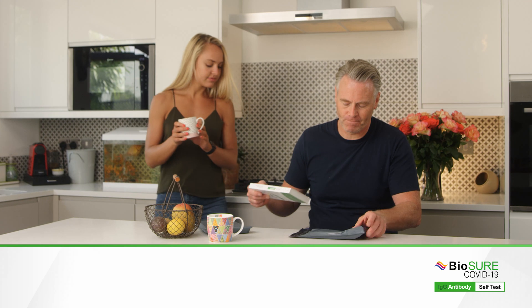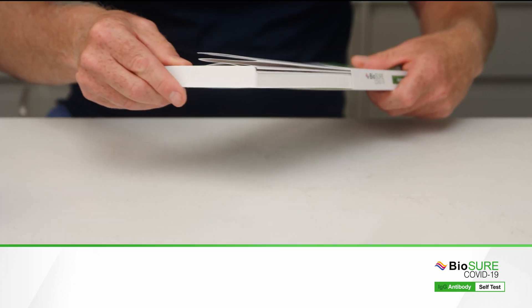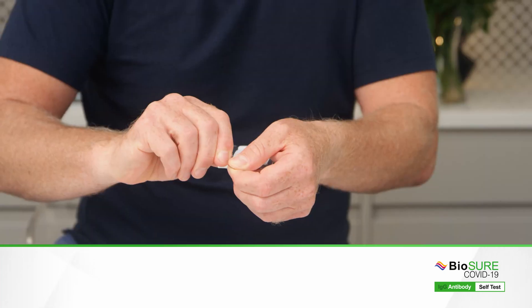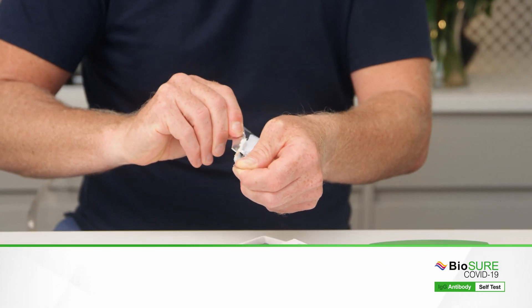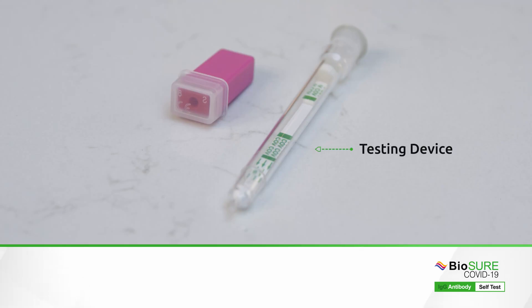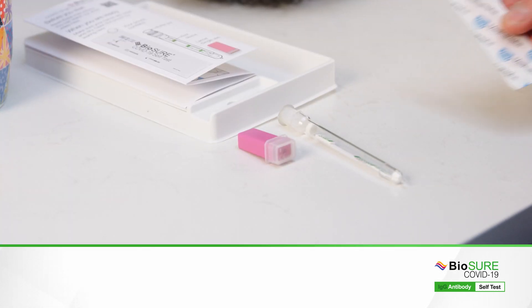When you are ready to test, open the box and carefully read the instructions. Tear open the pouch and remove the contents inside. You will find your testing device with the buffer pot in the top and a single-use disposable lancet. There is also a plaster for your convenience.